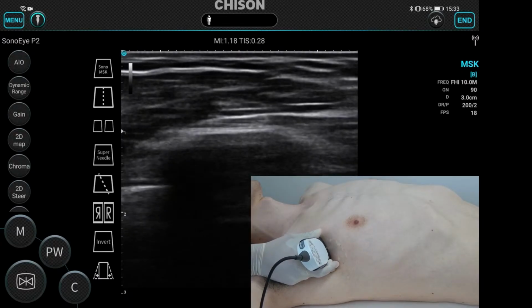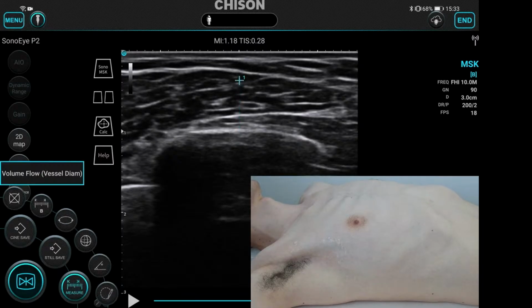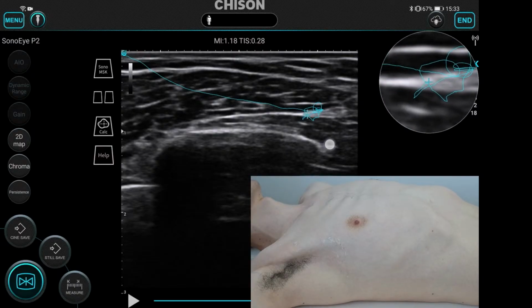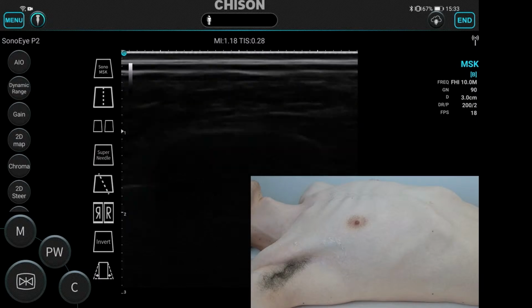So over here we have the serratus anterior muscle, and the target for this one also is in plane, and then go over here, either from the medial side or from the lateral side. You can insert the needle somewhere over here to hydrodissect the interfascial plane between the PEC minor and serratus anterior.